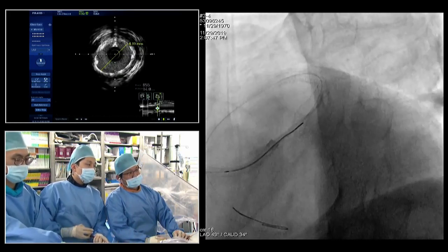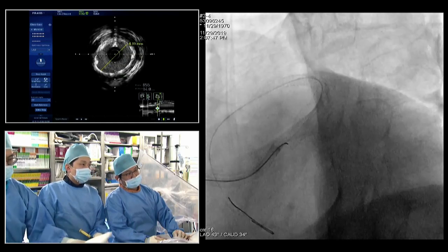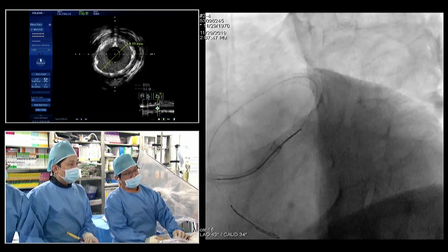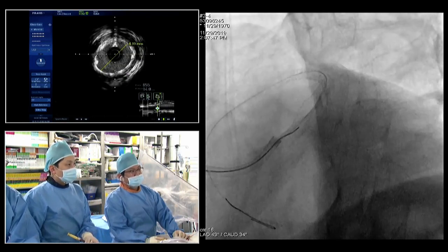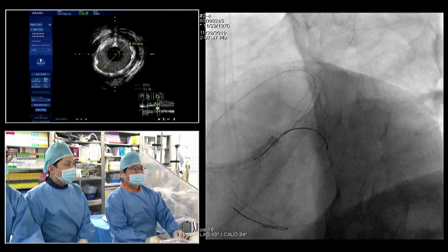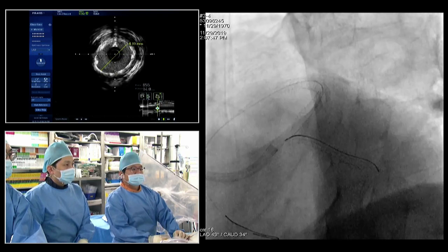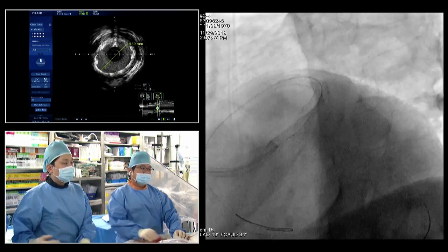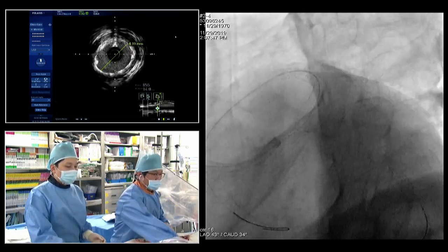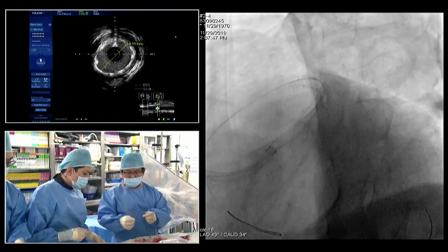So would you explain why a drug-coated balloon is a more preferable choice for Japanese operators? We don't perform complex stenting around the LMT. So to avoid complex stenting, one option is use of DCB in this situation. Of course, we don't have enough data. High pressure balloon, please.